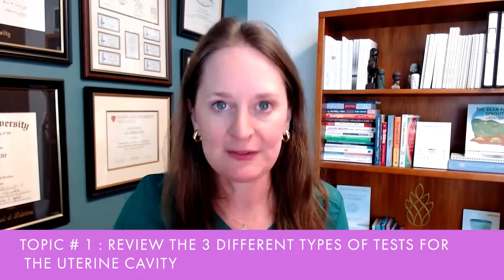Topic number 1, the different tests for uterine cavity evaluation. There are 3 options. Let's start with the HSG, or the hysterosalpingogram. Hysterosalpingogram is a long word which means HSG. Hystero stands for uterus, salpingo, tube, gram, study. So uterine tube study, hysterosalpingogram, or we just say HSG. HSG is a very common initial fertility test because it is a way to not only make sure the inside of the uterine cavity is nice and normal, but it makes sure that the fallopian tubes are open.